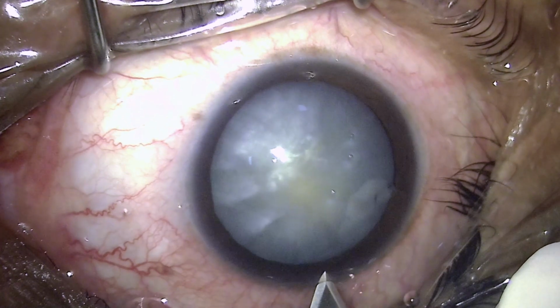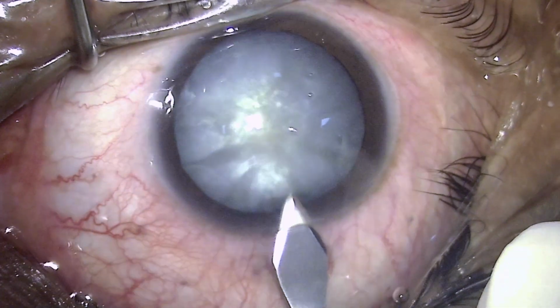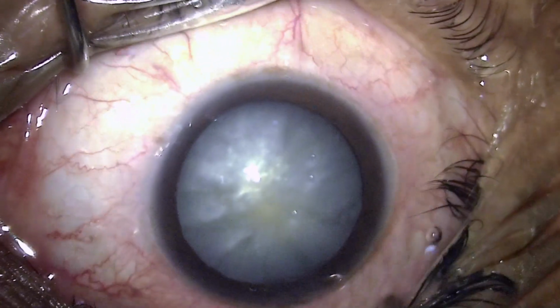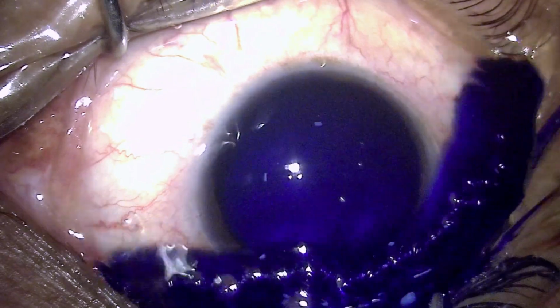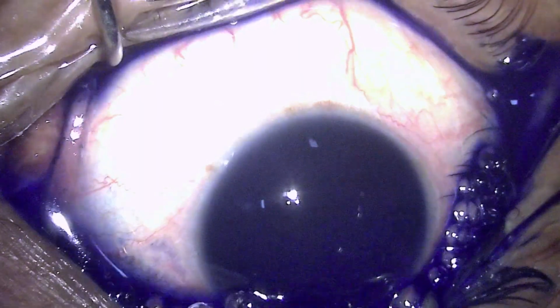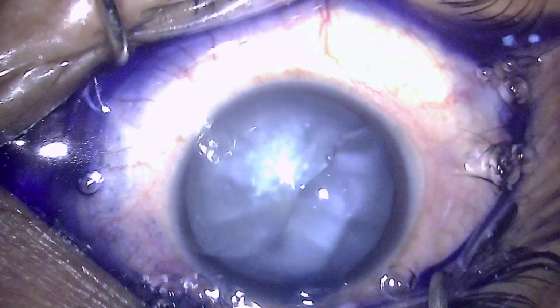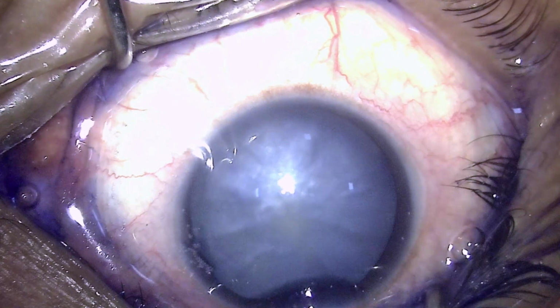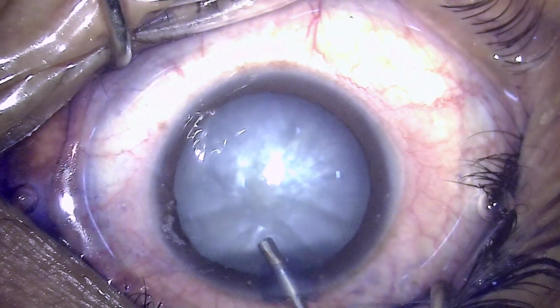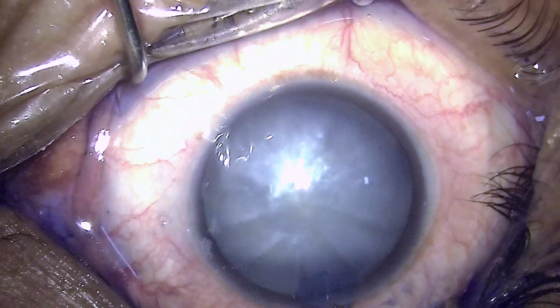Now these intumescent cataracts have a tendency, just like a balloon which is inflated, that the outer capsule is very under stress. So the moment you make a nick, it tends to rip, and that is why it's very important that you have to have a controlled rhexis in these cases. Otherwise the capsular rhexis will simply extend to the periphery. So this is where the issue or the concept of double rhexis comes in.